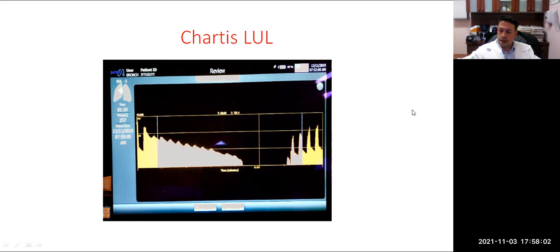But I have seen fissures where you look at it and say, I think I see a small interruption in one area. Mostly the fissure looks fine. It's over 90%, but I'm worried there's a small interruption. You bring the patient in, you inflate the balloon, and guess what happens? You have a very nice slow decrease in the flow until you get down to about 10%.